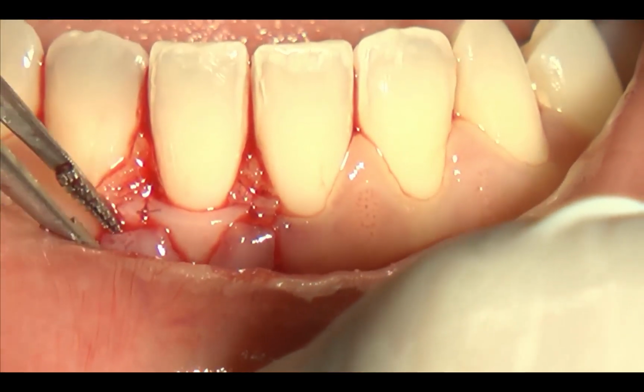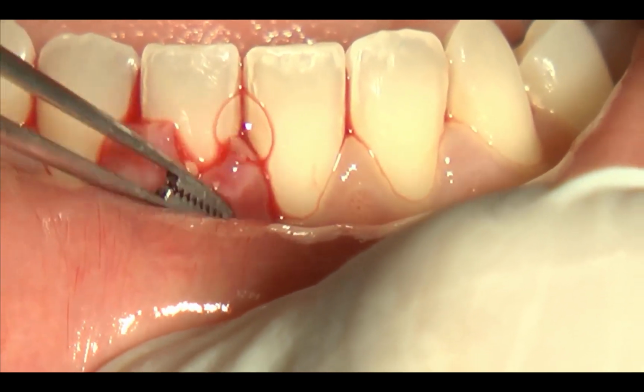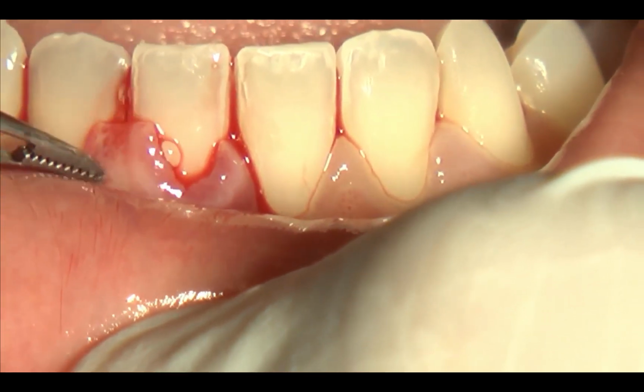Papilla. So in the final position they have to be sutured.